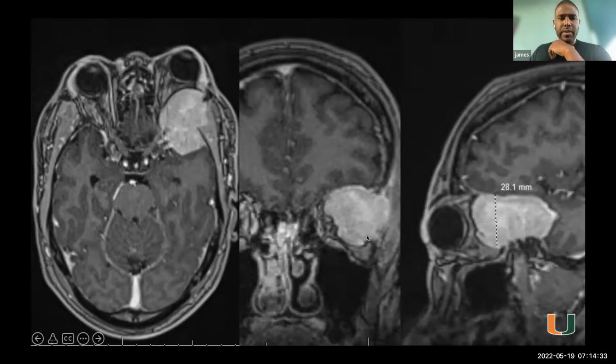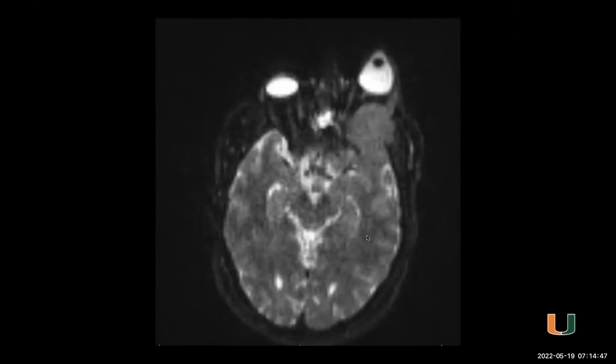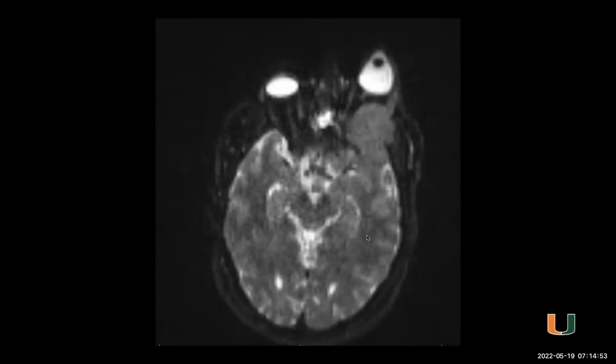Okay, perfect. And I don't know if I have another scan. And then here, what sequence is this? I'm just thinking for someone who's immunocompromised, comes in slightly altered, uncooperative. Yeah, it looks like a DWI. It could be like an abscess or something. Exactly. One of those things that you just don't want to sit on, especially if it's that large.